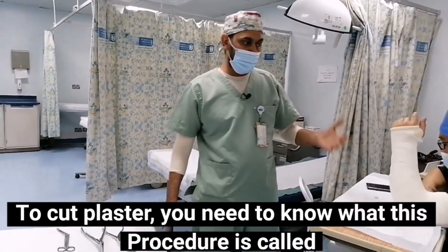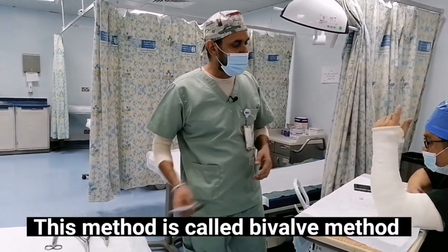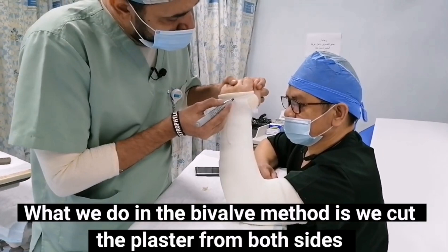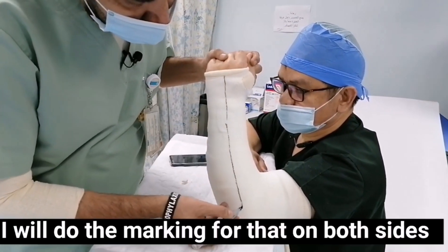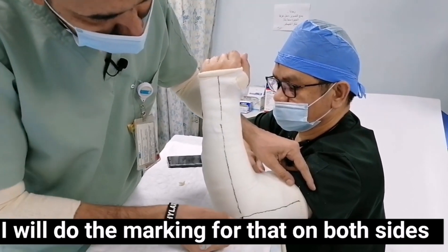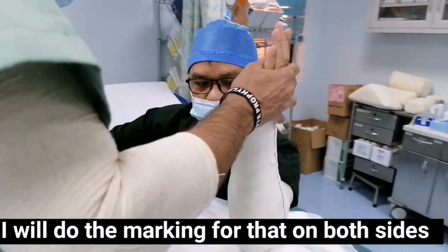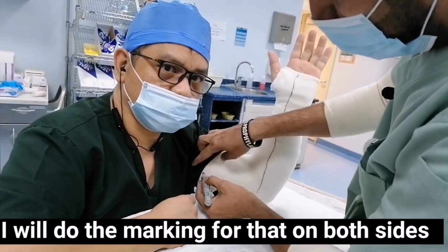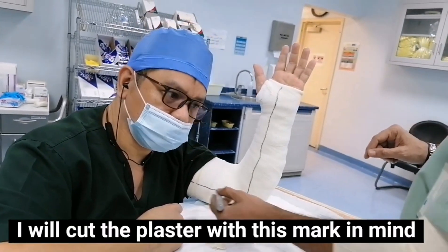To remove a plaster, you need to know what this procedure is called. This procedure is called the bivalve procedure. What we do in the bivalve procedure is that we cut the plaster from both sides. I will do the marking on both sides, and I will cut the plaster with this marking in mind.